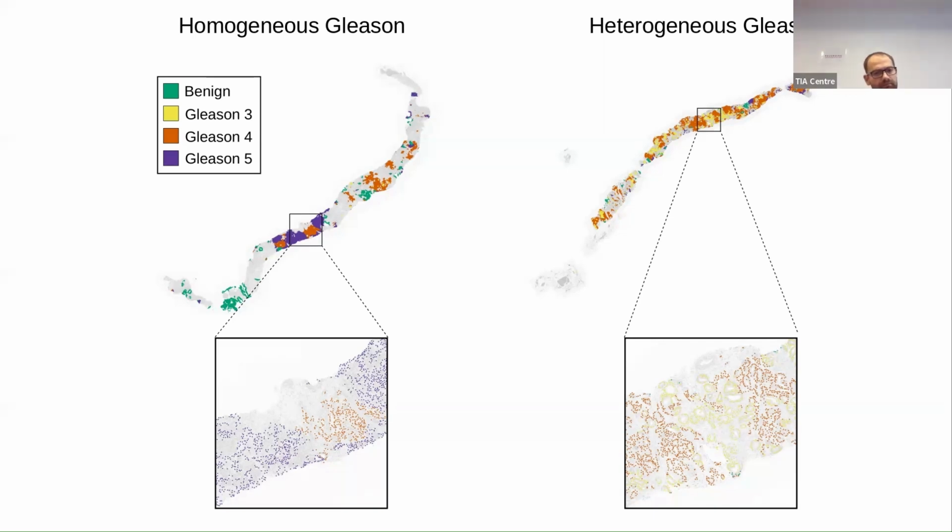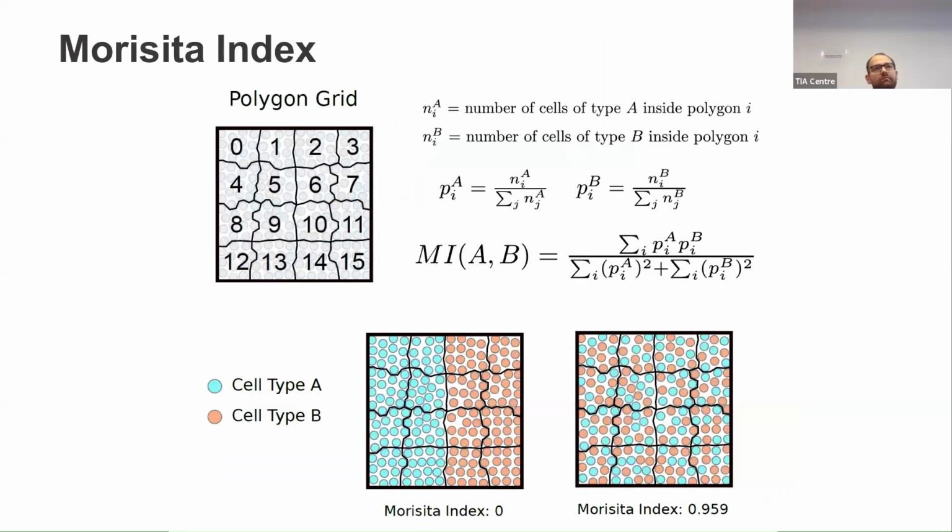Are they just different ways of presenting a 3+4, one that is blocky versus one that's all mixed together? Are they different, or are they both 3+4s that just look slightly different, basically? And one thing I wanted to do was try and capture that level.